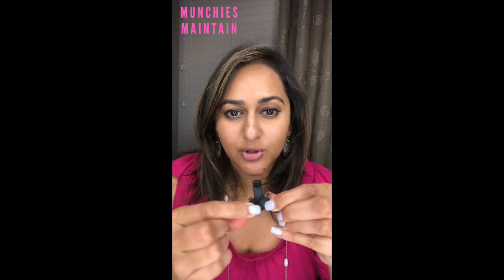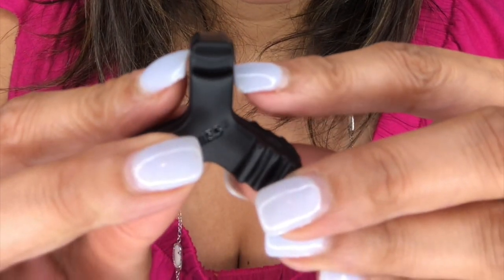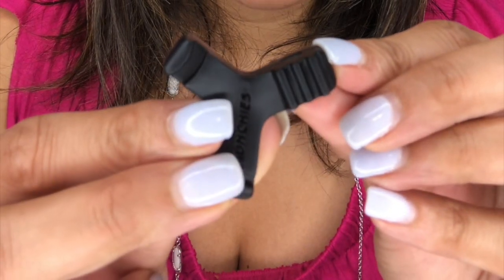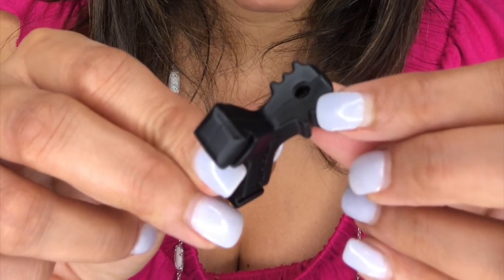The next product I'm going to review is the Munchies Maintain. This is by far the thickest and most durable of all the Munchies we've had so far. Similar concept — we've got the larger slot for the upper teeth, a slightly smaller slot for the lower teeth, a serrated-looking slot for your posterior molar teeth, and then the canine notch.